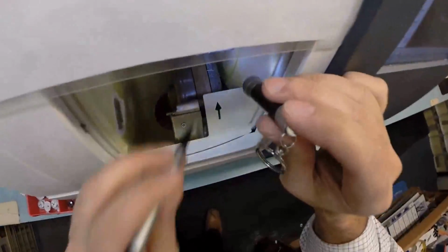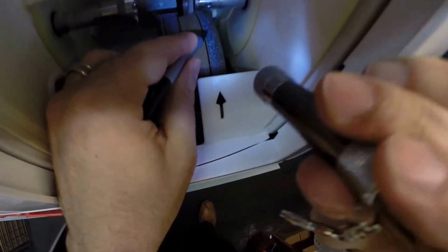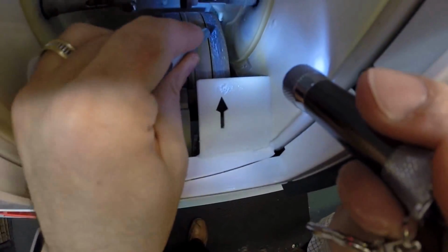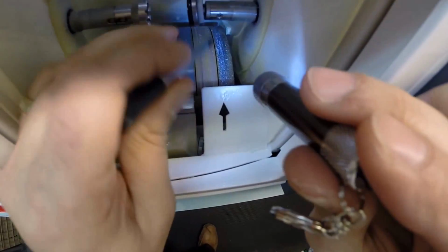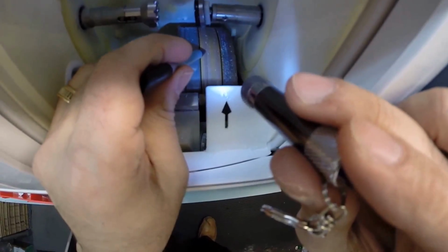So the actual cutting wheel is over here on the far right of the machine. That's going to grind away your lens material until it's the final shape. Now this wheel here with that little groove, that's what's going to put the bevel onto the lens, which is the V shape, the knife-like bevel, so it will stay inside the bevel of the frame. And let's just see it in action.